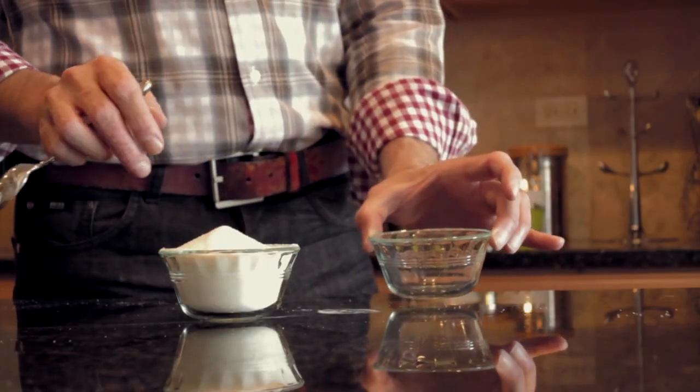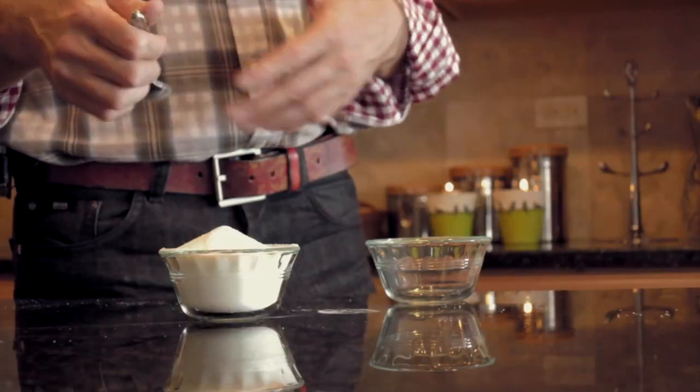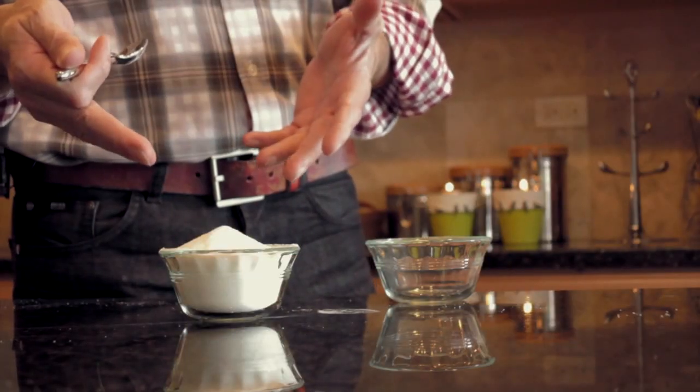For my analogy, I have two bowls — one full of sugar and an empty one. The goal here is to think of the sugar as the dentinal chips that are going to be cut with the file, and then the goal is what to do with these dentinal chips. Obviously your goal is to transfer these chips from inside the root canal to outside the root canal.